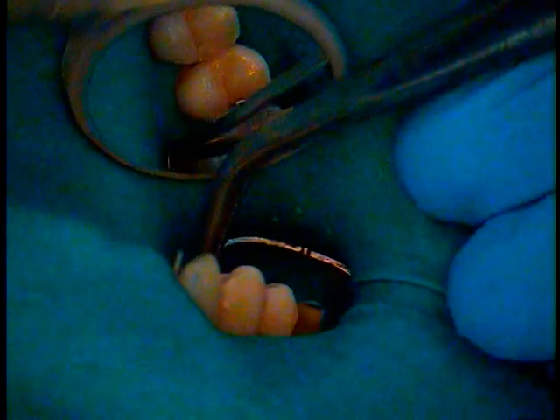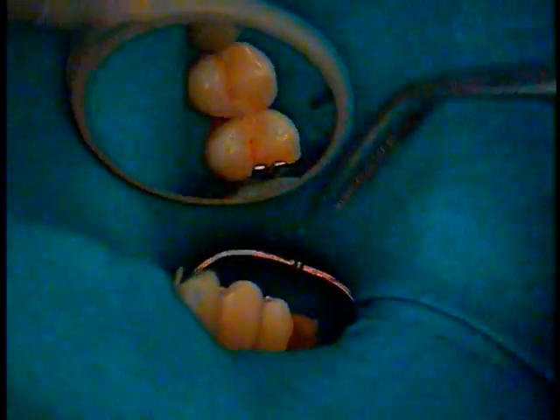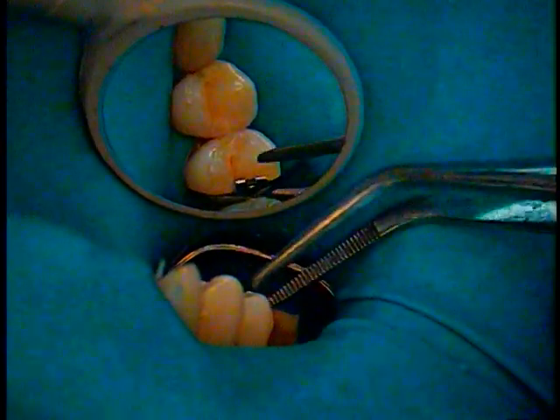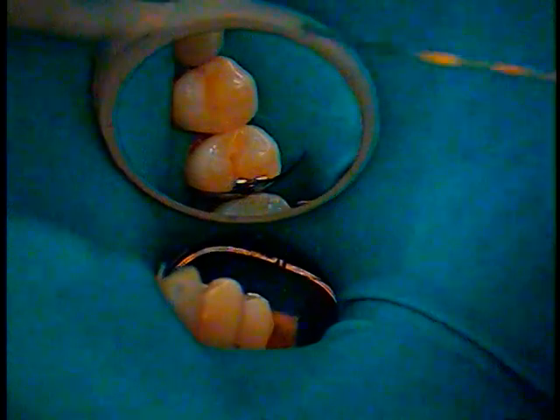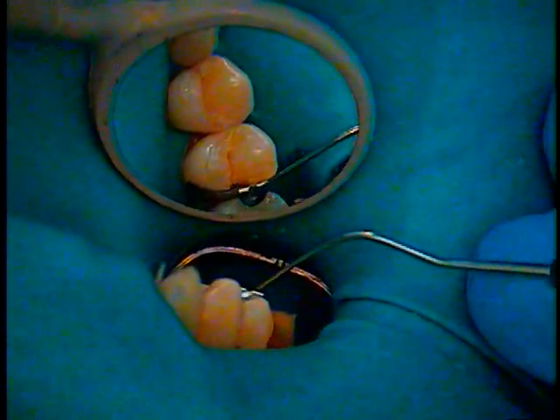I'm going to just reduce the mag first and push it in place. Get really good isolation. Very important. You don't want any crevicular fluids whatsoever. Sulcular fluids are a no-no. Causes hydrolysis to occur at the surface of the bond itself, the resin itself. Don't want that. That little tab's bothering me, so I'm going to move that tiny little tab out of my way so I can visualize.